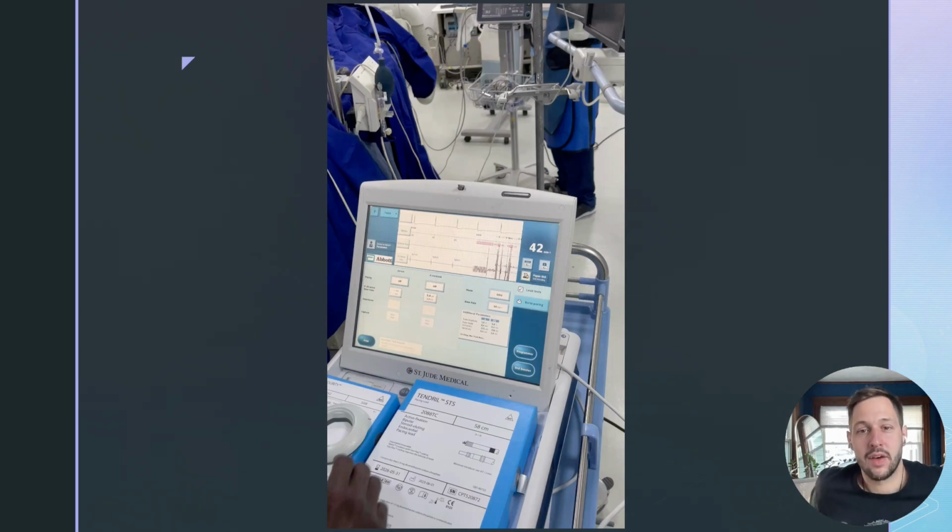all right, so we have a Merlin programmer. The lead is already screwed into the tissue of the heart. It is now sticking outside of the pocket, and the physician took the PSA cables, took the black to the tip, red to the ring, and then that cable is running here to the PSA and plugged into the RV or middle port of the PSA, which is why we're seeing on the EKG or the surface this evoked response.